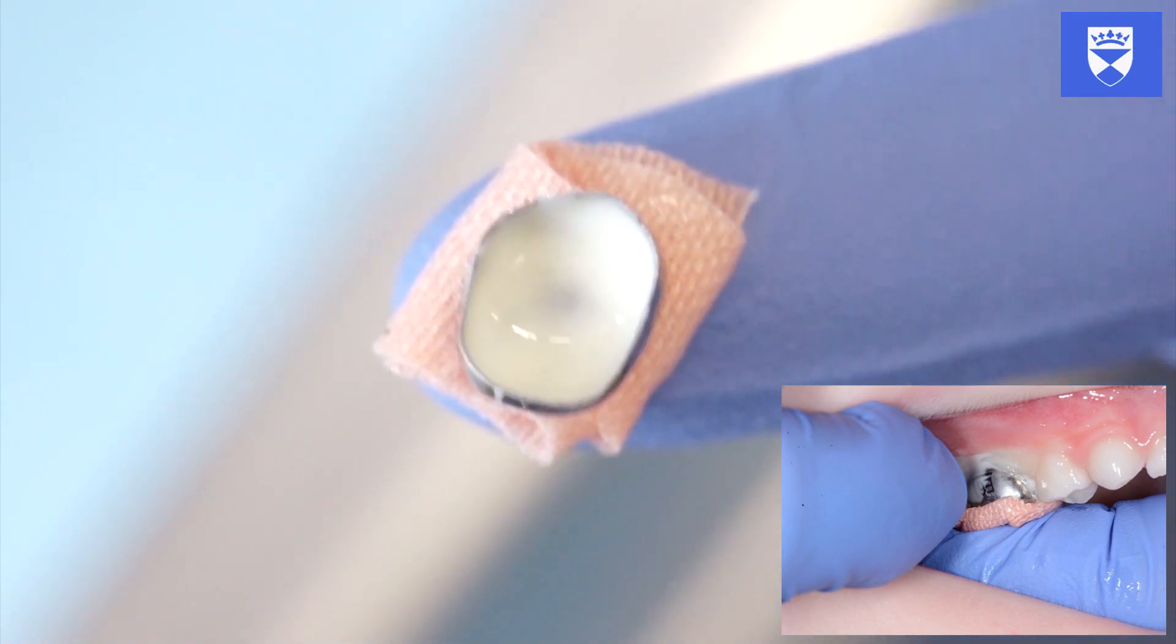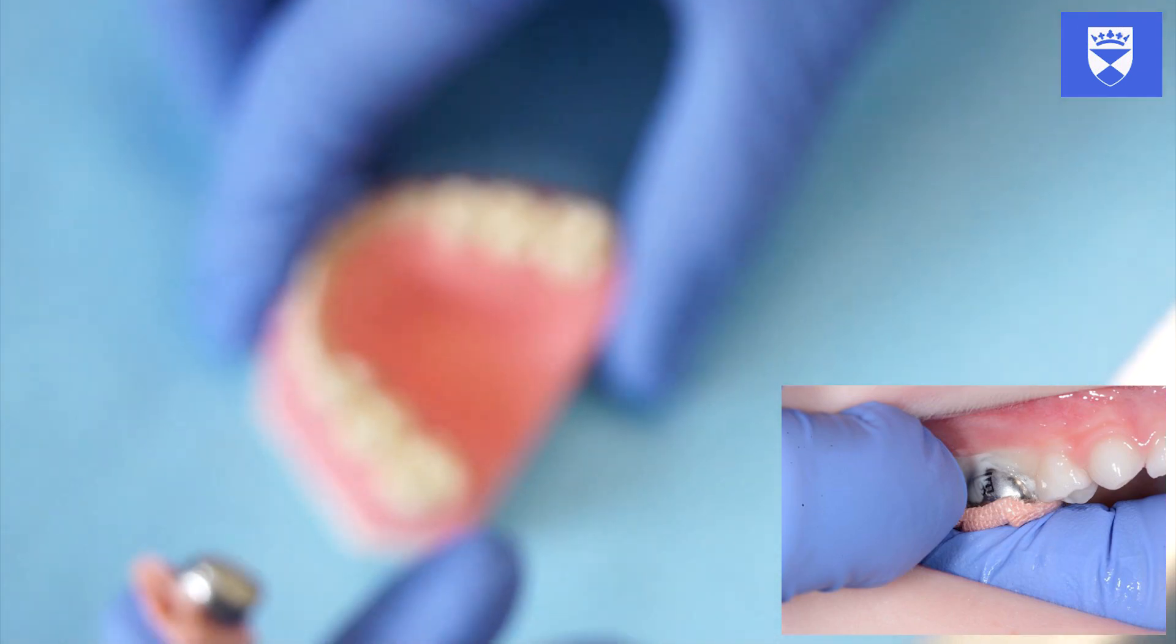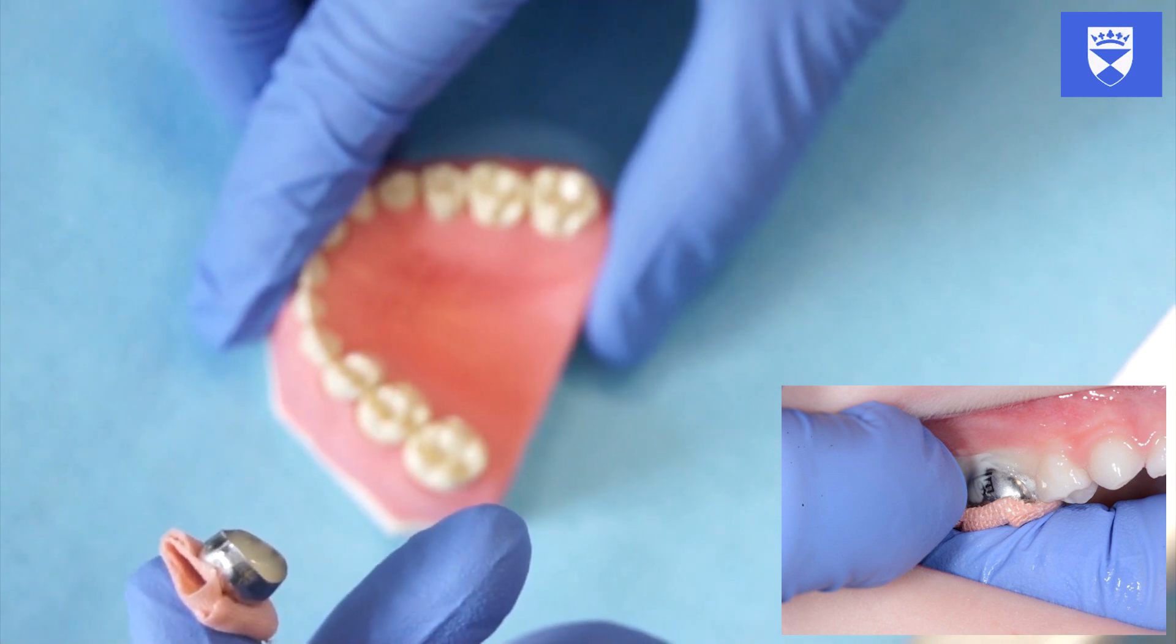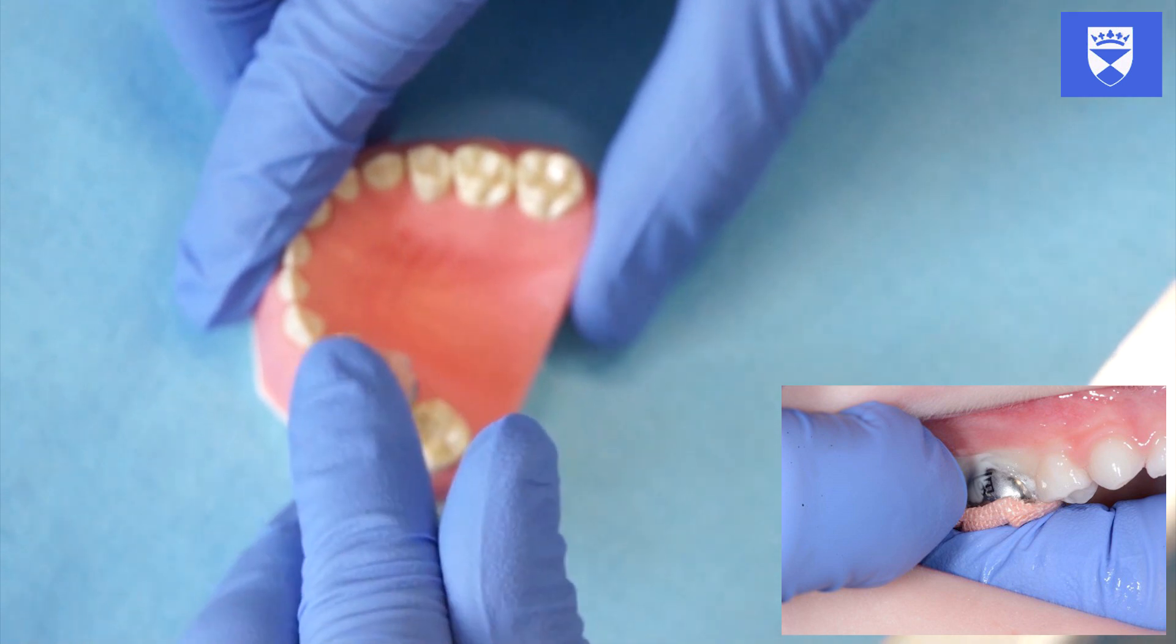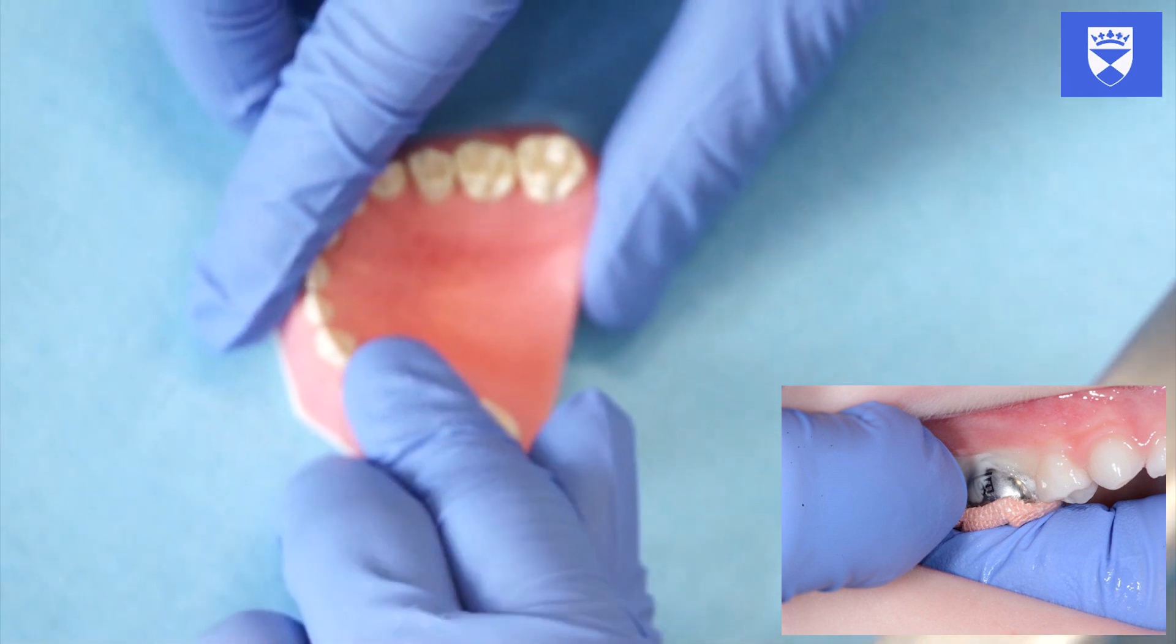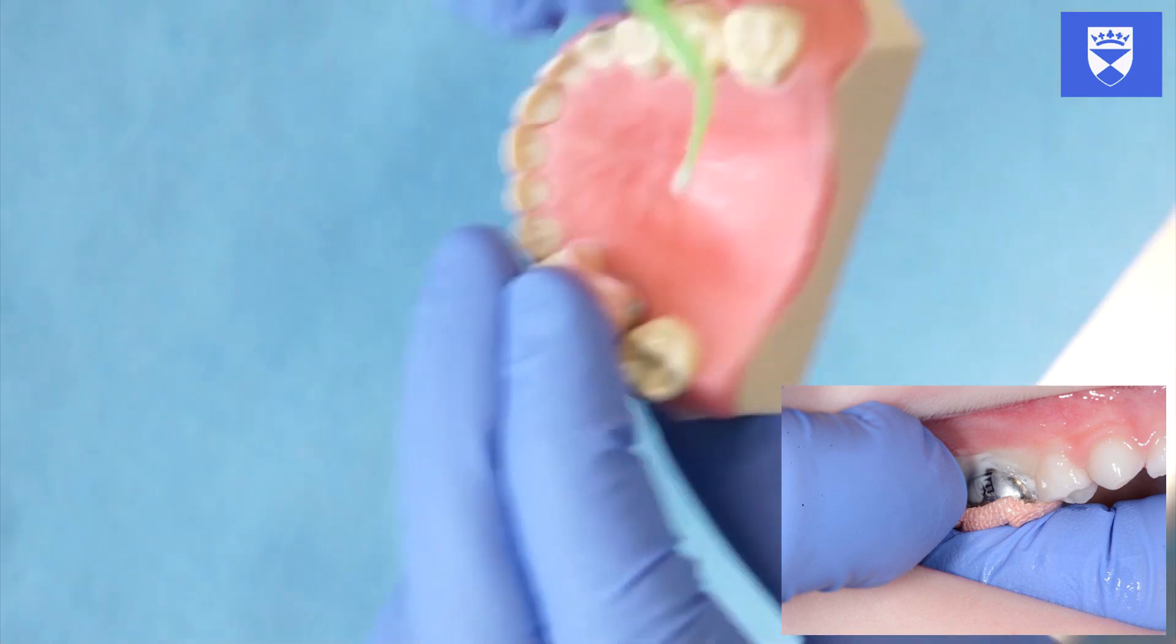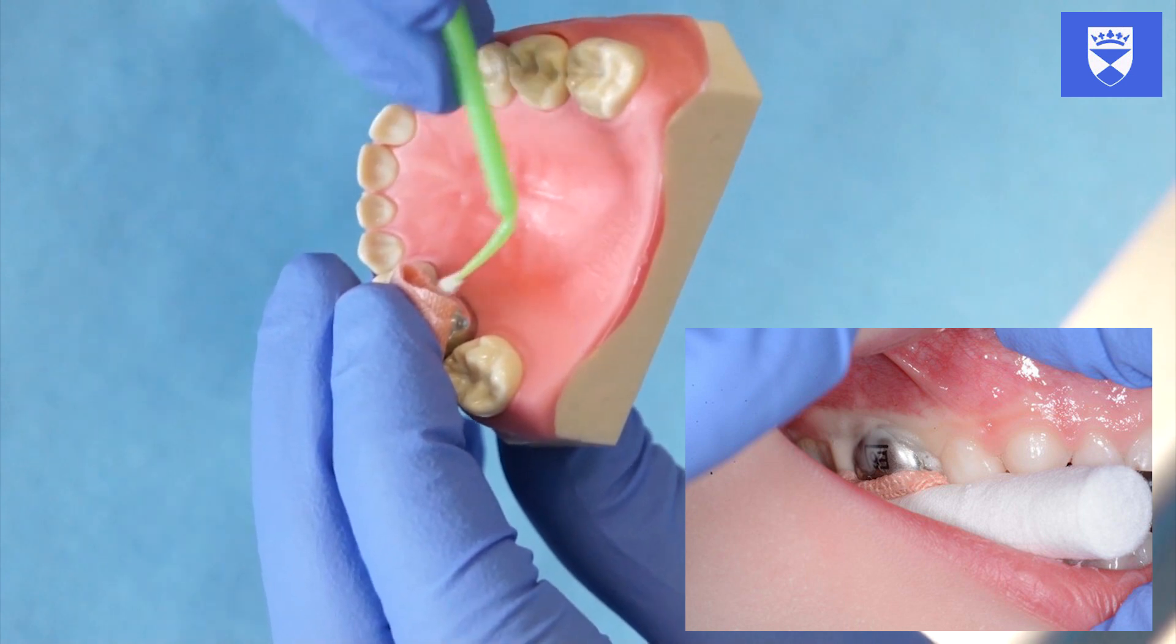Place the crown onto the tooth applying firm pressure. Quickly remove any excess cement. There are two ways to ensure that the crown becomes fully seated. Continue to apply firm pressure with your finger, or alternatively instruct your patient to bite down firmly on a cotton wool roll placed over the top of the crown.